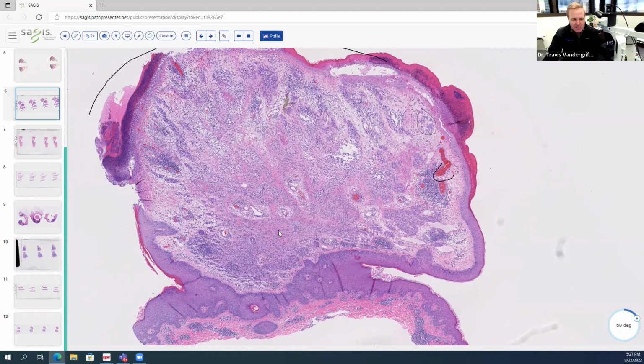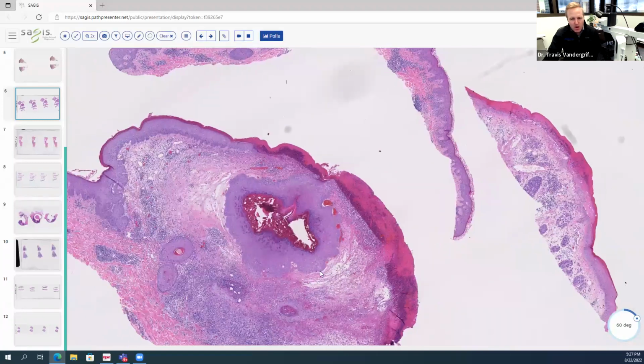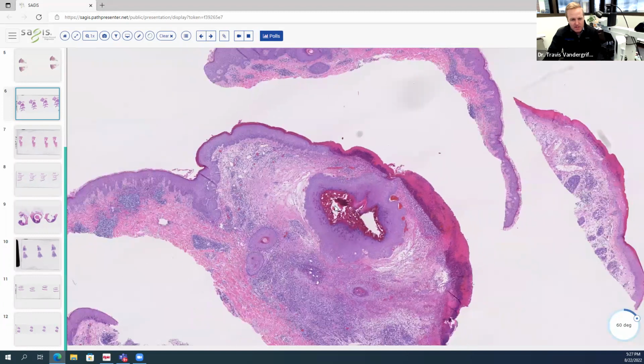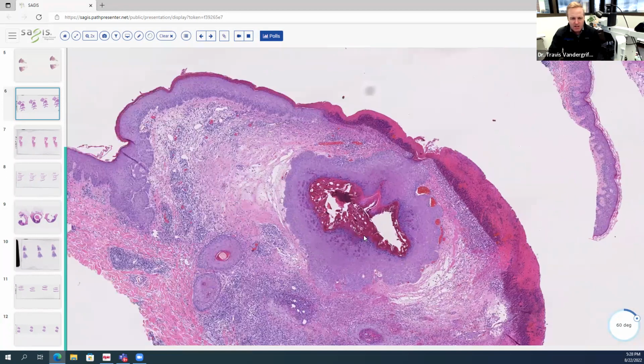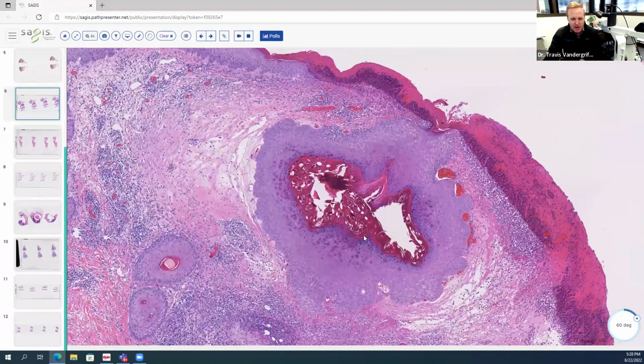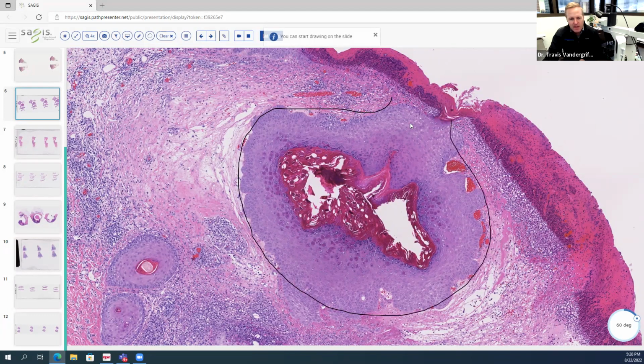And I would think of it as an intradermal nevus that has been traumatized and become ulcerated, and hence some granulation tissue resembling a pyogenic granuloma. You also have, this is like the third diagnosis in this slide. So this is kind of an interesting combination and one that is not necessarily a common scenario. You also have this invaginated epithelium creating a little cystic space.